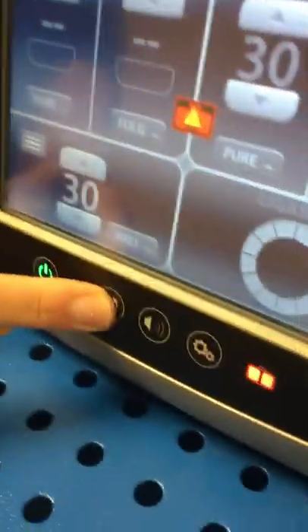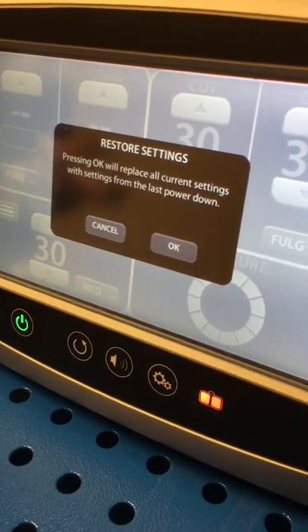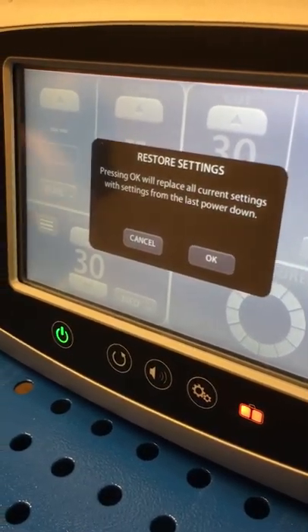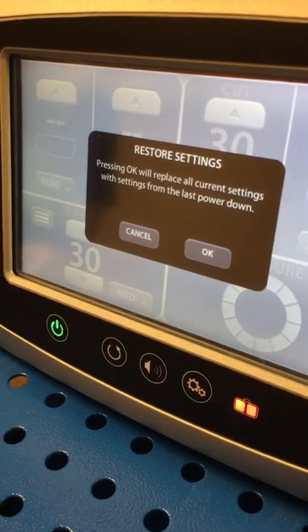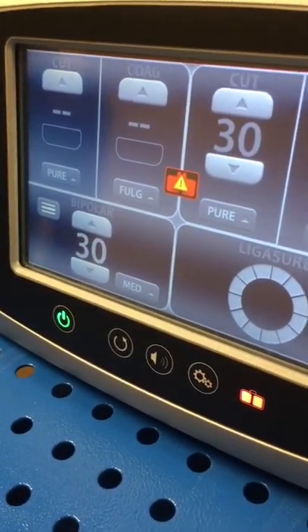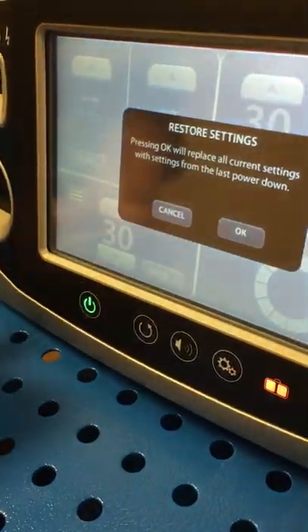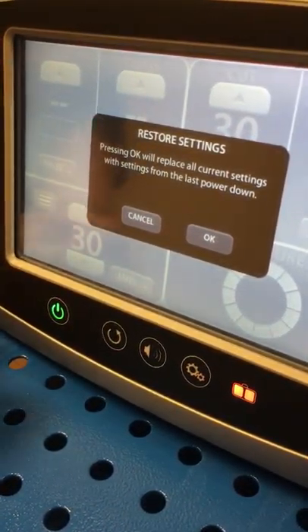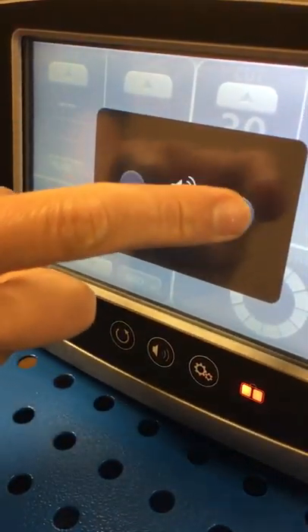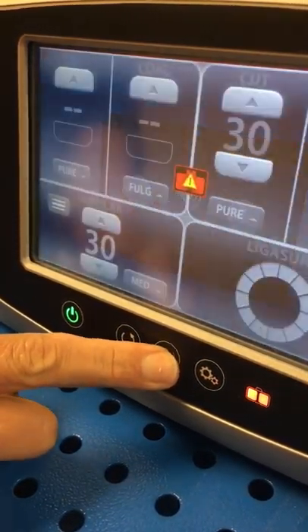This next button here is a restore settings button. When you want to go back to previous settings, this is the button you can use. For example, if you're working with the same surgeon all day and housekeeping comes in between cases and the machine gets unplugged and you just want to go back to previous settings from the case before, you can press that and it'll take you right back to how you had it set. The next button is volume — it's a touch screen so you would just adjust the volume up or down using that volume button.